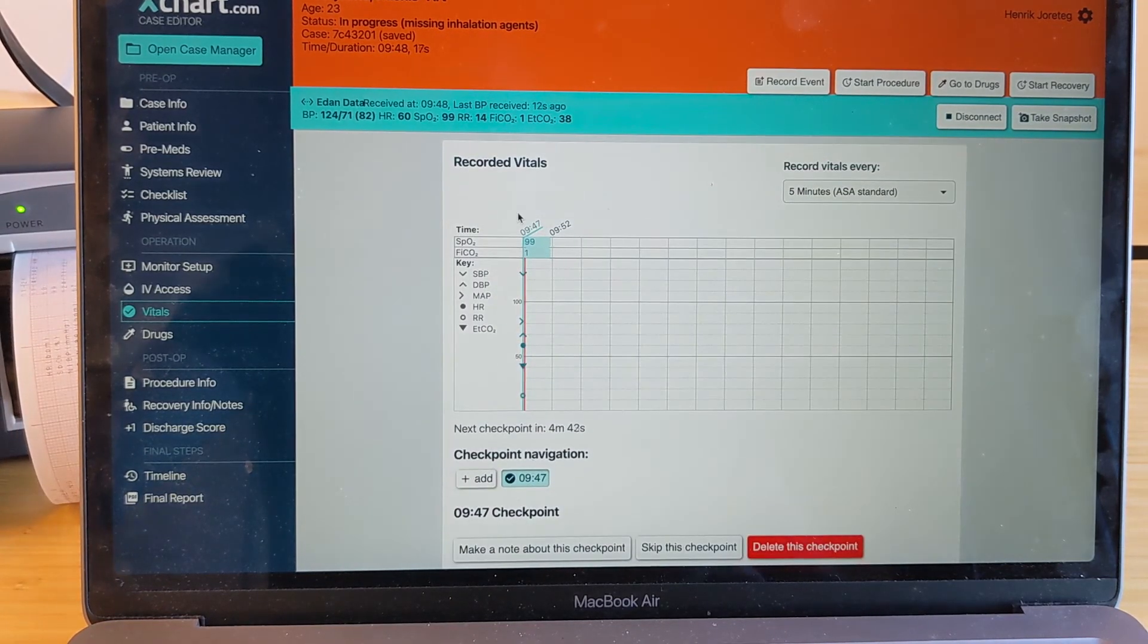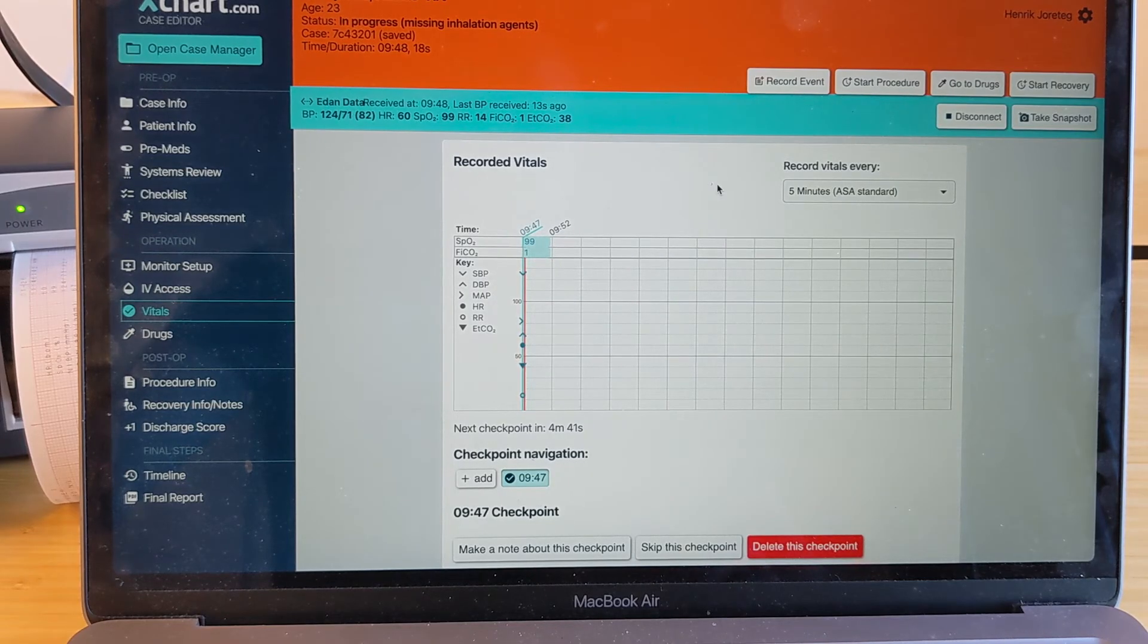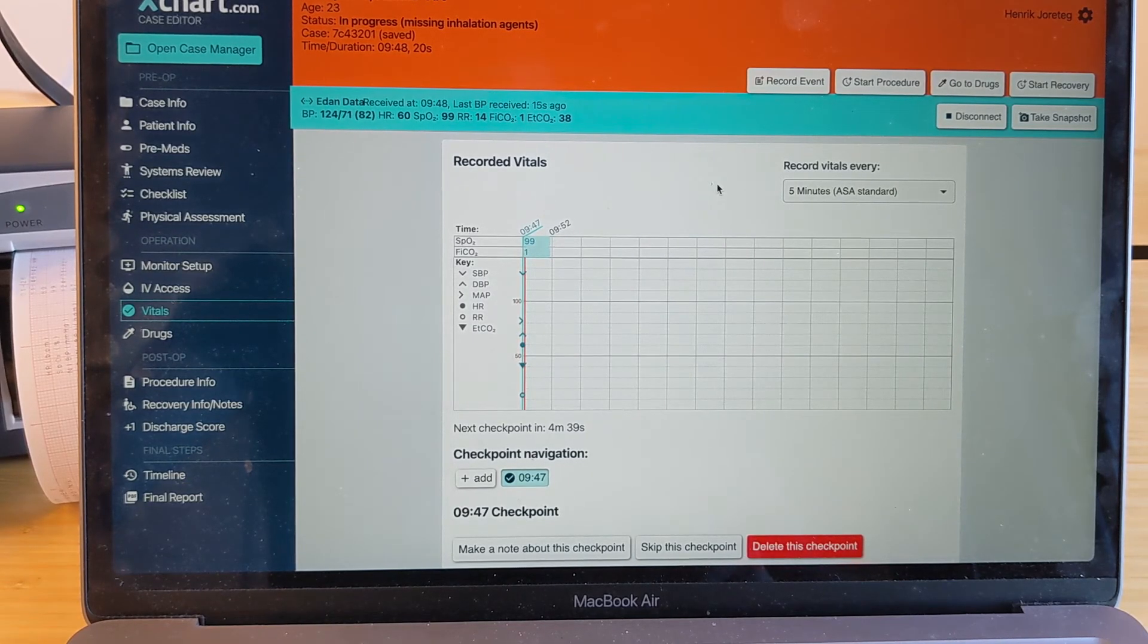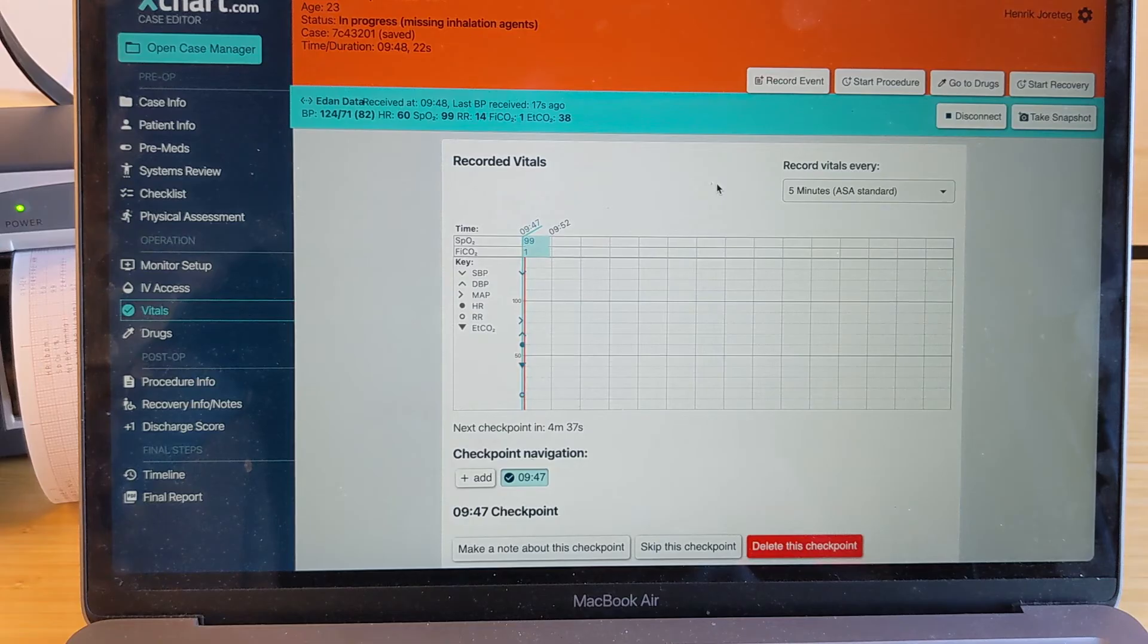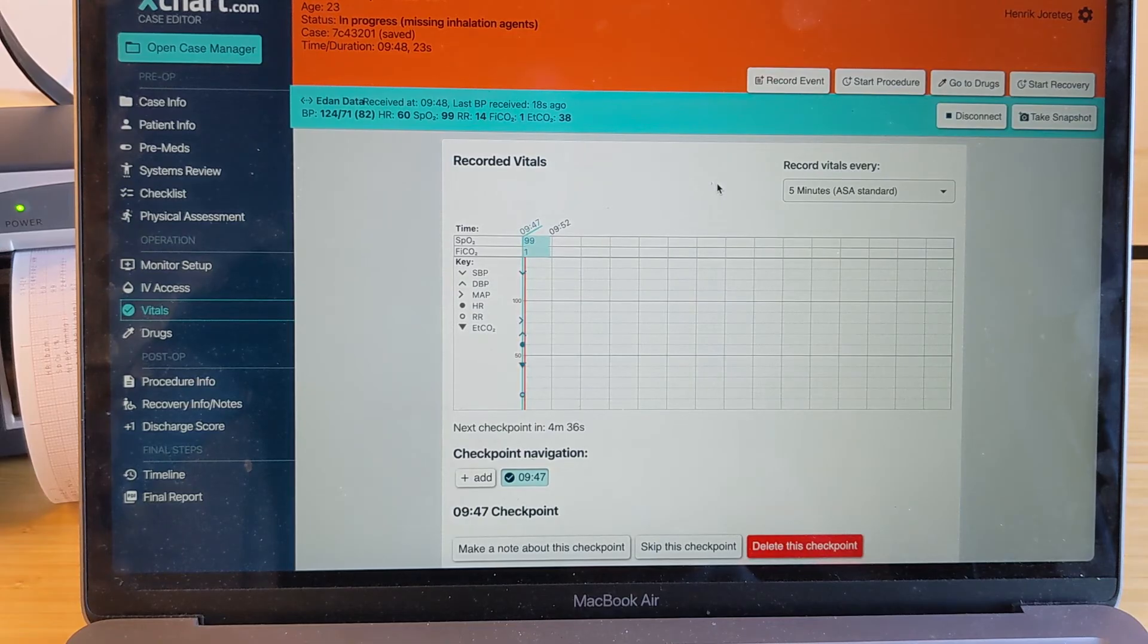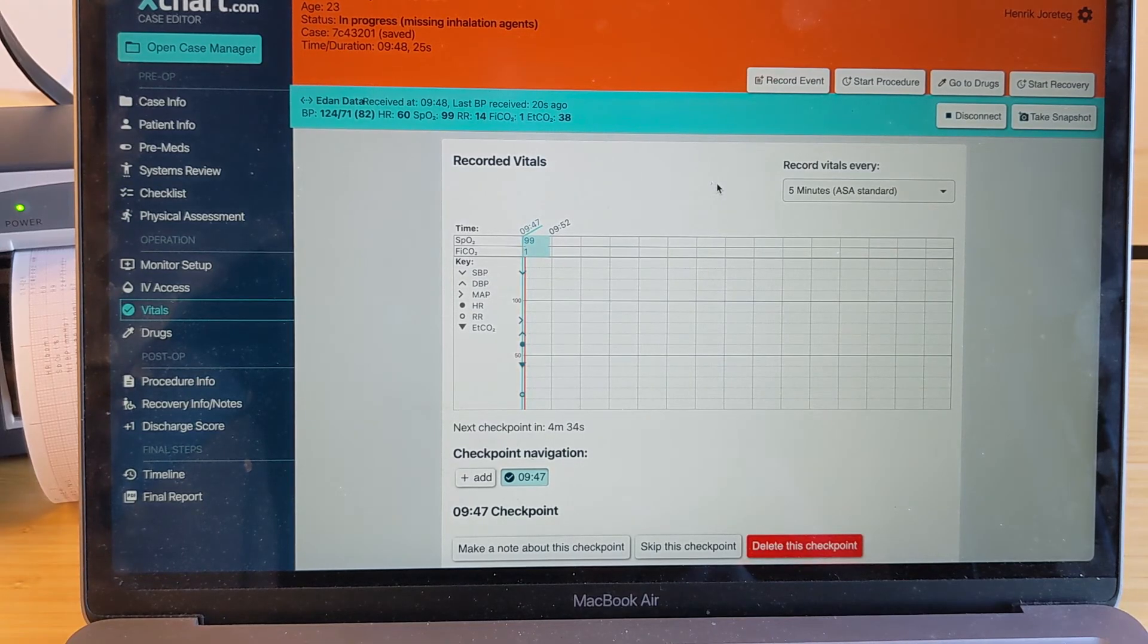And at this point, as long as you're seeing the blue bar across the top, you know that you have an active connection and that everything is being captured. Really, that's it. Thanks for your time.